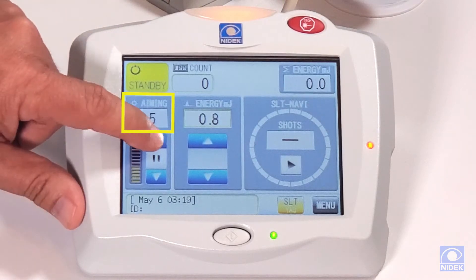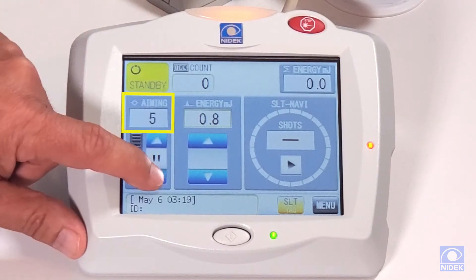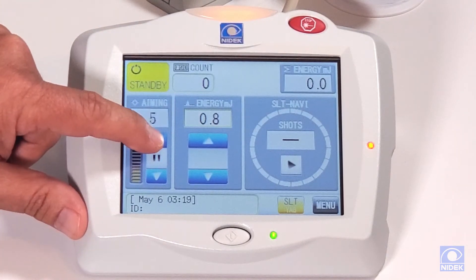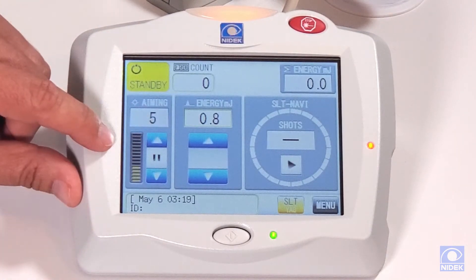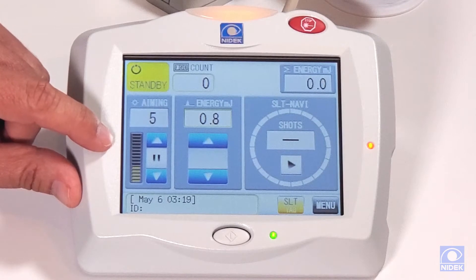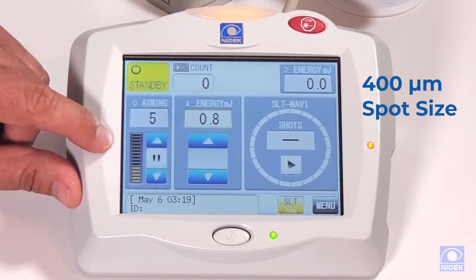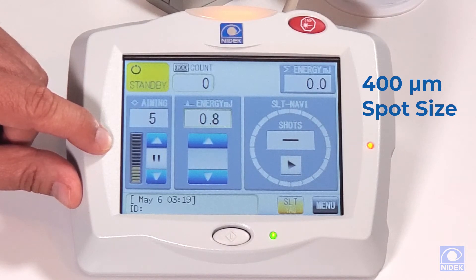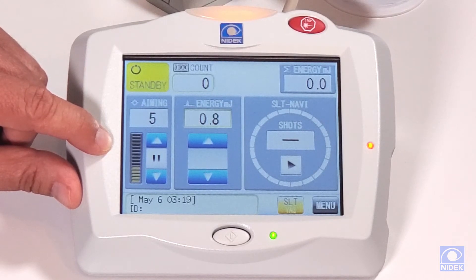This is our aiming beam intensity — we can increase and decrease it. One important thing about our aiming beam is that it is a 400 micron fixed aiming beam. With our technology, we have a precise edged aiming beam for precise treatment.